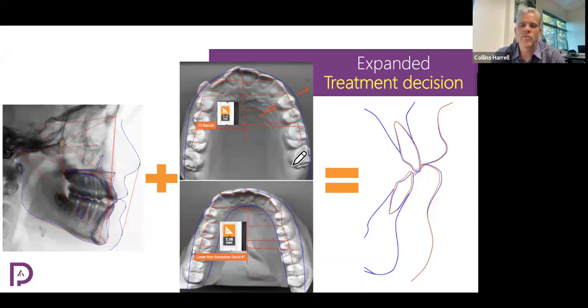And that's just to overcome the flexibility of the aligner and the tendency of the teeth to tip buccally, by pushing harder on the roots, basically pushing hard at the gum line to try to get those roots to go out to the buccal. That's a case where, if you're having a problem with it, you could request in a revision aligner a straight trim line that's up higher on the gum line, which would have more impact and more effect on the gingival portion of that tooth to control that torque.